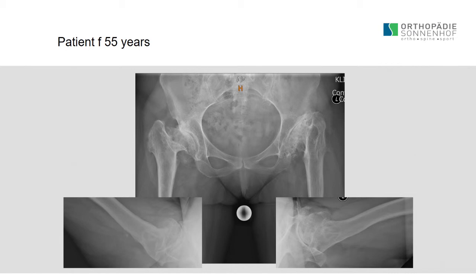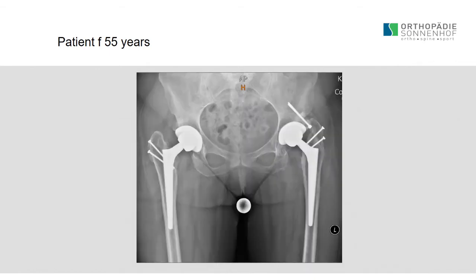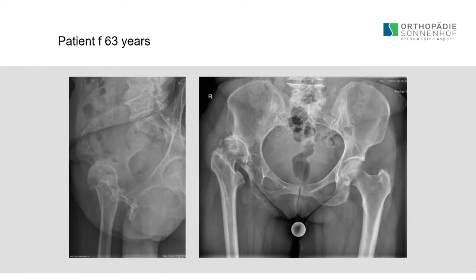And what you can do in those cases, you will have to find a compromise with still some kind of high riding trochanter, because the musculature, which is usually quite long in high riding DDH, is not long in a stiff hip, and you have almost just scar, and it will not help you to bring the trochanter down, because you will destroy the whole musculature in the trochanteric area, so the abductors.